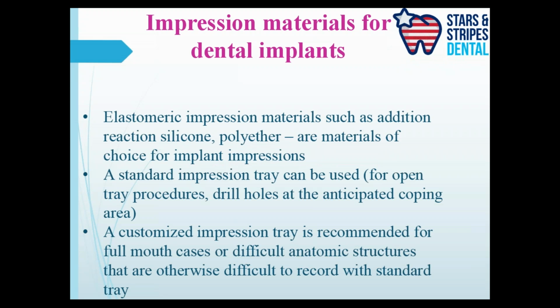We all know we are prosthodontists in some ways. We take impressions in our daily practices, be it crown and bridge or denture or diagnostics or whatever. And we are well aware of the materials that are available, and we pretty much use all of these materials in our daily routine practice one way or another. So the alginate impression materials, the elastomeric impression materials, and so forth.